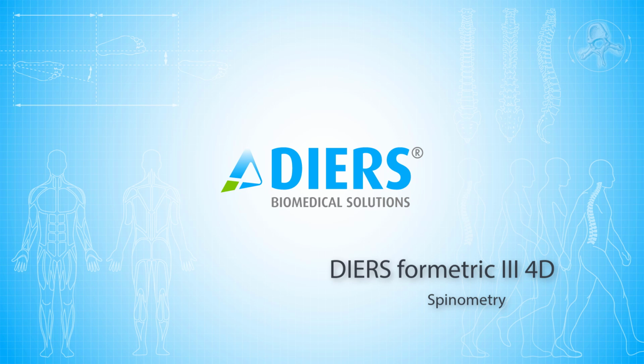This video is an introduction to the result interpretation of a formetric examination and is meant to set the reference for a better insight of its basic clinical meaning. In addition, it ensures a good understanding of the cases you can also watch on this platform. So, without further ado, let's start with this session.